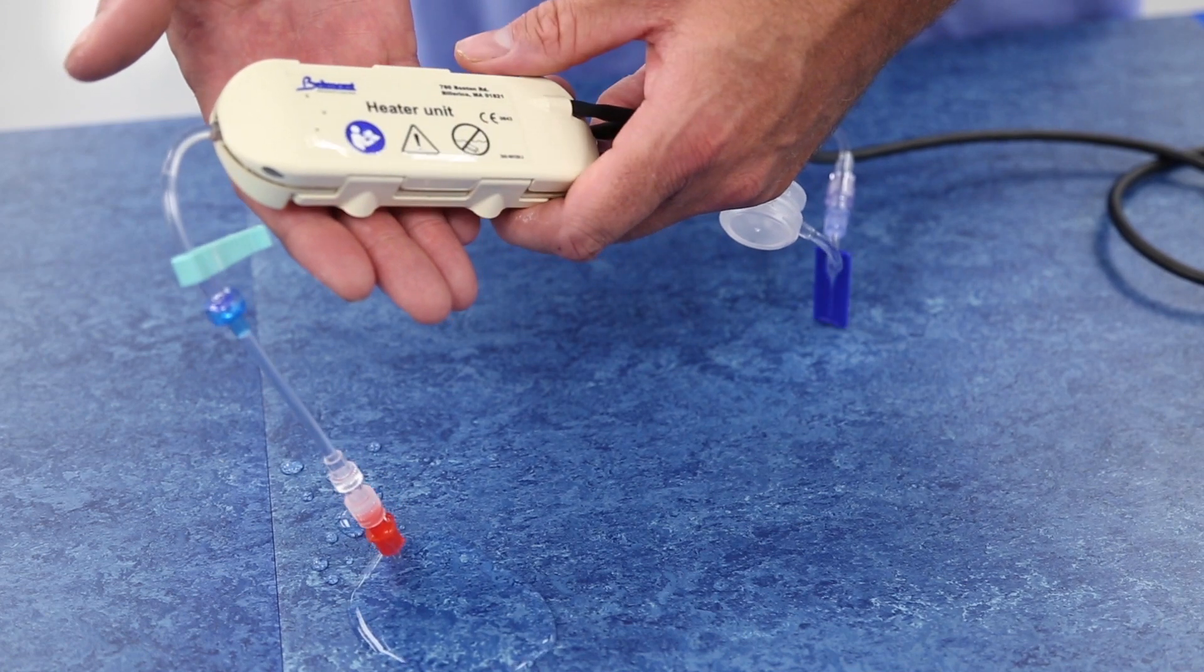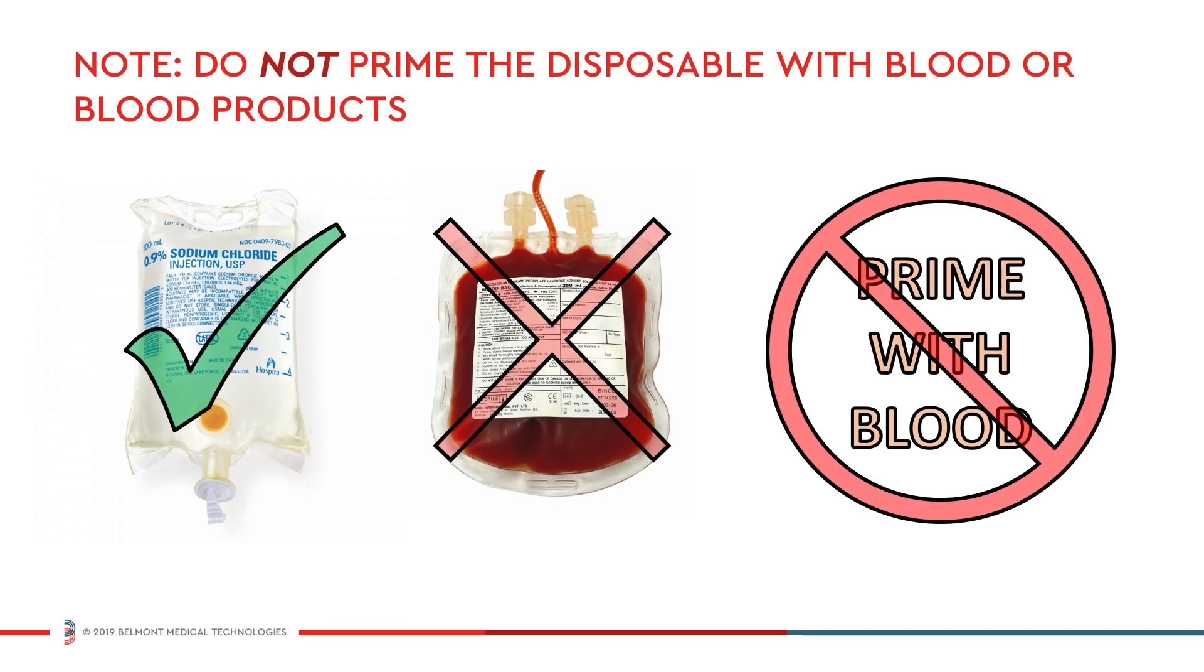When you are sure that the disposable is primed and free of air, proceed to powering on the device. Note, do not prime the disposable with blood or blood products.